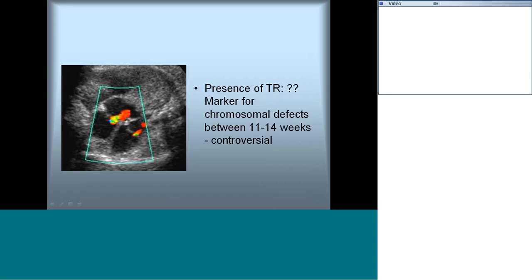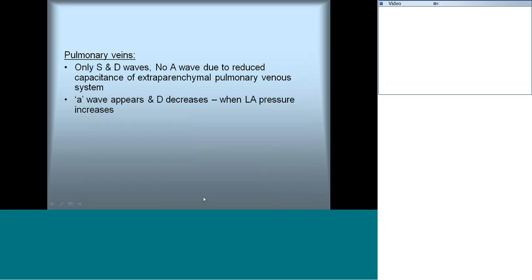Any amount of tricuspid regurgitation is abnormal, especially when seen earlier in gestation — it is controversial, but most agree it is a marker of chromosomal defect. Pulmonary veins are extremely difficult to obtain, but later in gestation some venous flow can be appreciated showing S and D waves. No A wave should be present in pulmonary venous flow because of the lower capacitance of the pulmonary venous system. If an A wave appears and the D wave decreases, it indicates elevated LA pressures.